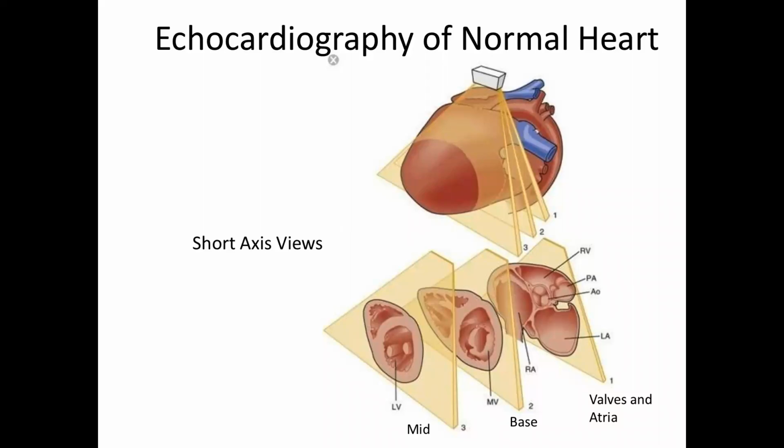And so that's how you detect ischemia, i.e. a lack of blood flow at that location, is that the heart wall muscle itself is not contracting. And so normally the tech will get a mid view, a base view, look at the valve planes, and then move the transducer and get apical views as well. Right? And so that sort of samples the whole object.